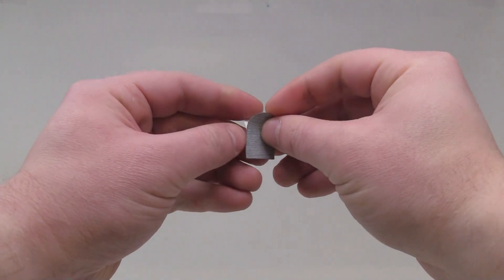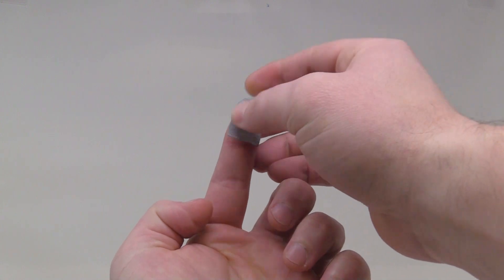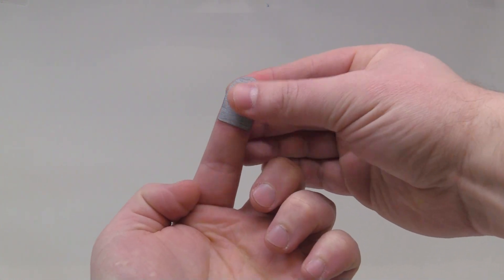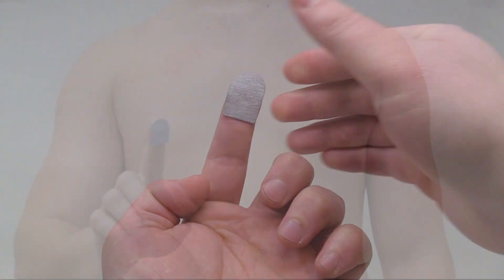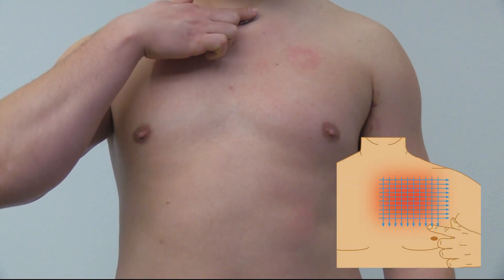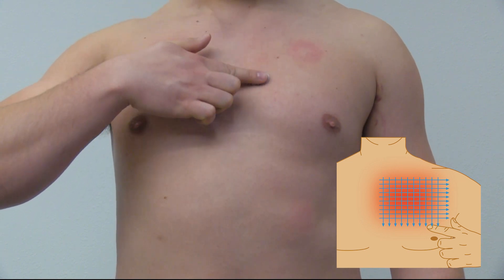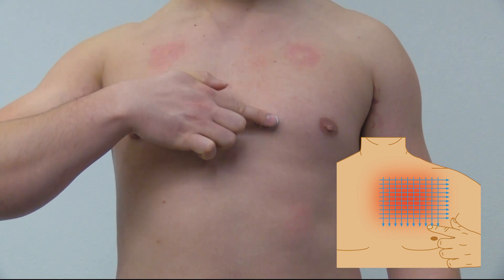Locate one of the provided abrasion pads and remove the release liner exposing the adhesive. Adhere the pad to your index finger. Starting at your sternum, abrade the skin by applying pressure 10 times in each direction for a total of 40 strokes. Ensure to abrade a large area, as it is important for adhesion and connection.